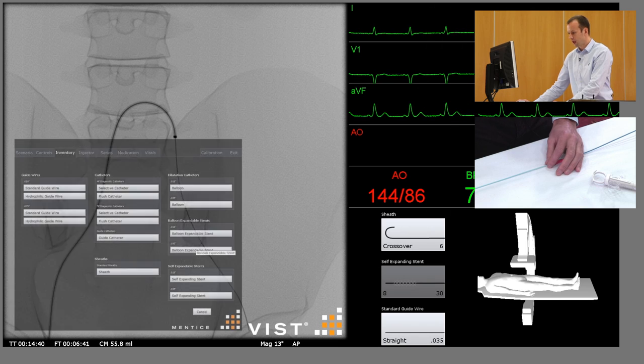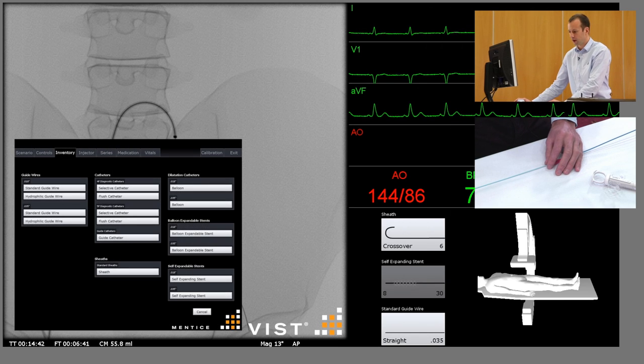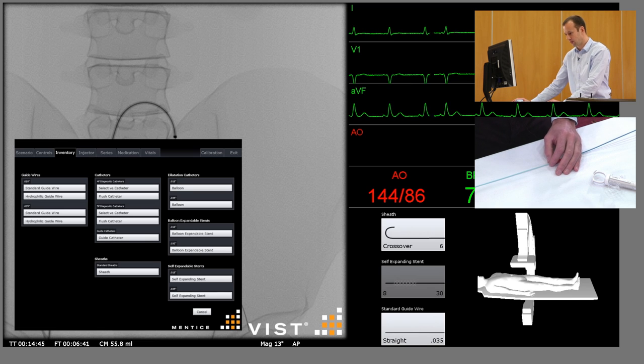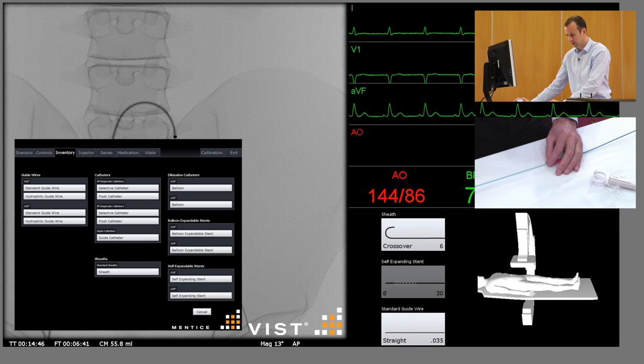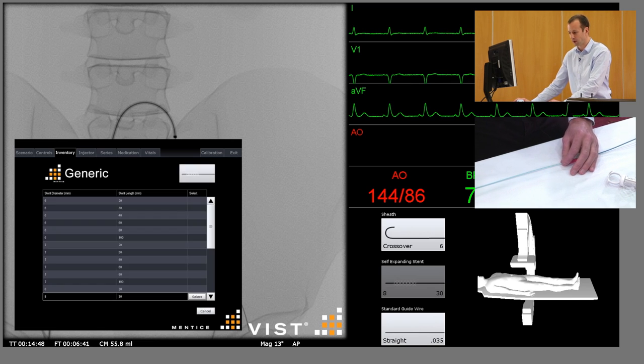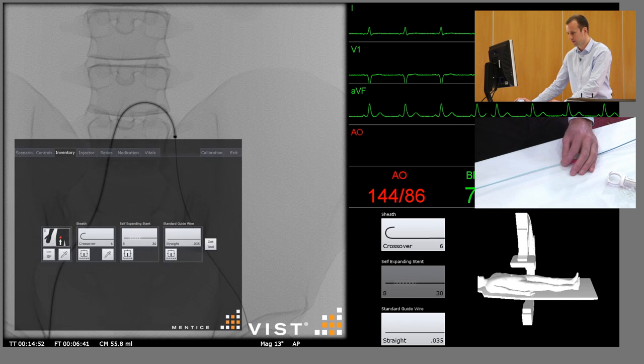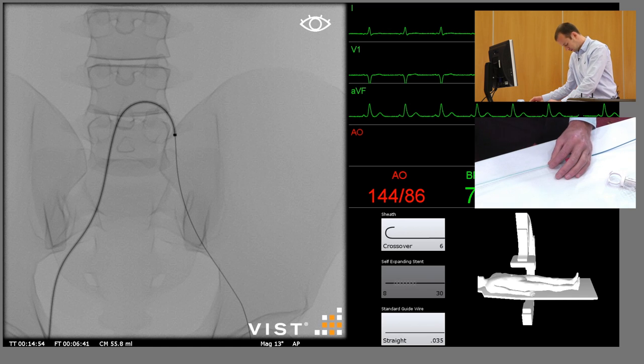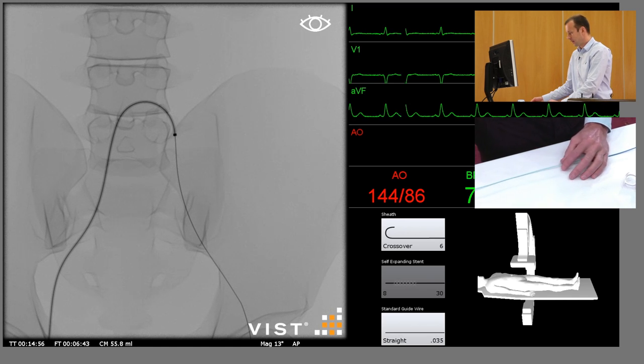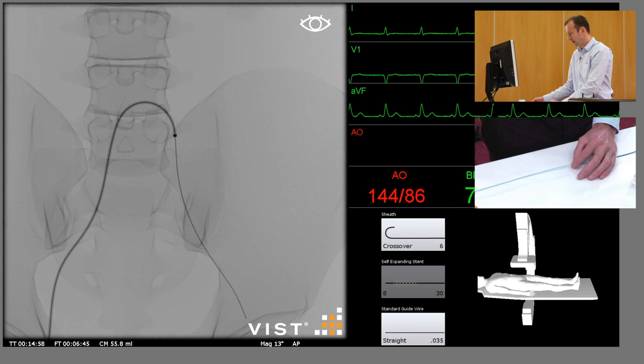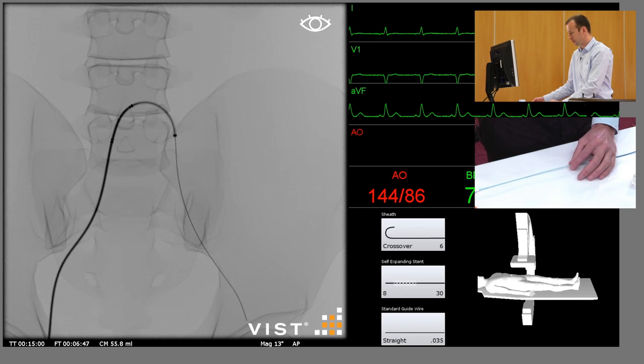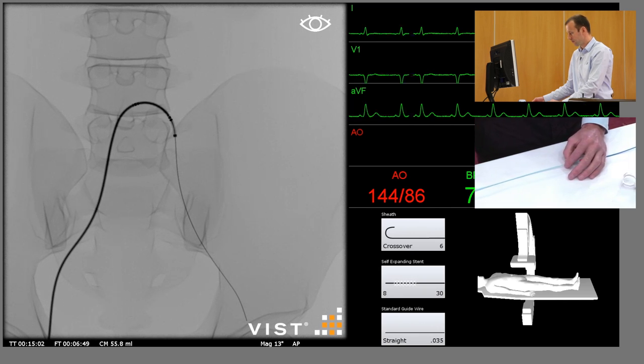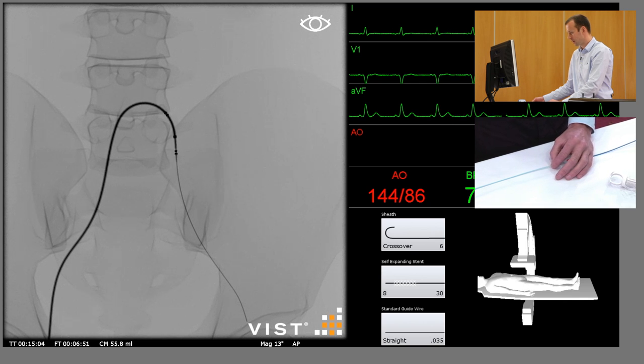At this stage we need to select the appropriate stent. We know from the pre-operative CT scan that that is an 8mm by 3cm stent, so we can select this from the menu and insert it over the guide wire, again trying to keep the tip of the guide wire just in view. And then go very carefully when crossing the lesion.